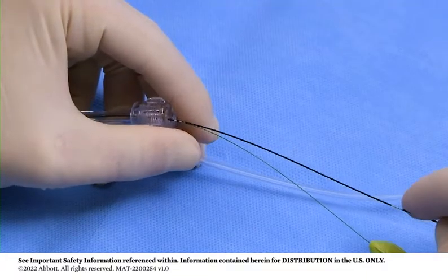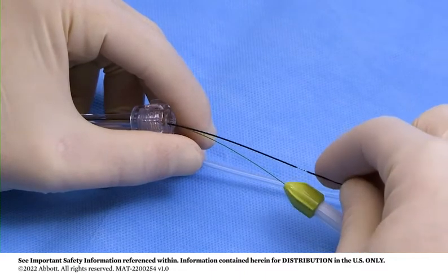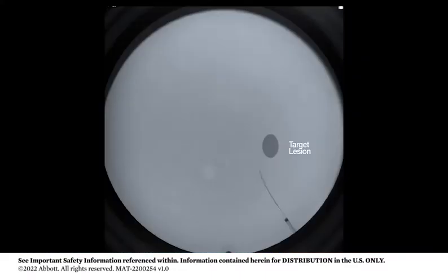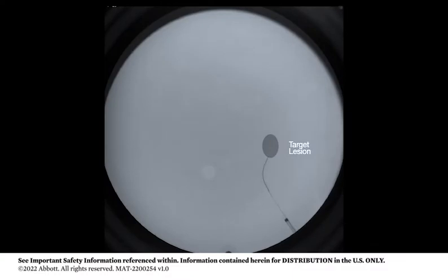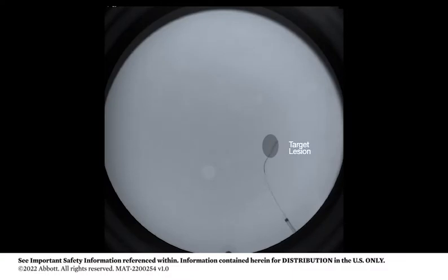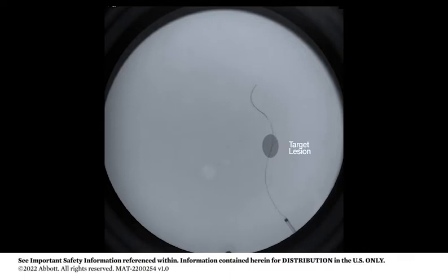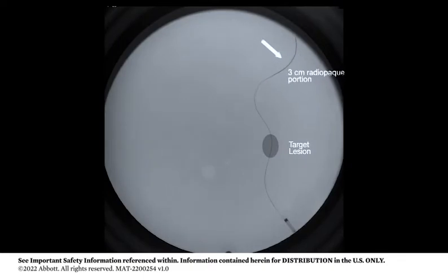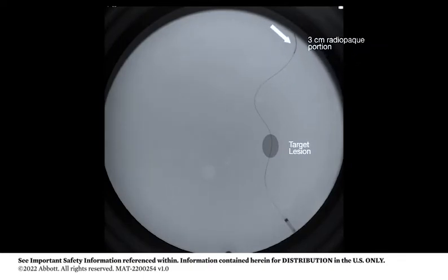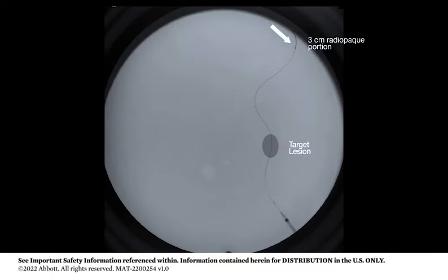Advance the delivery catheter through the guide catheter or introducer sheath to a location proximal to the lesion. Advance the bare wire across the lesion. Position the 3 centimeter radiopaque portion of the bare wire in a suitable section of the vessel distal to the intended filtration element deployment site.